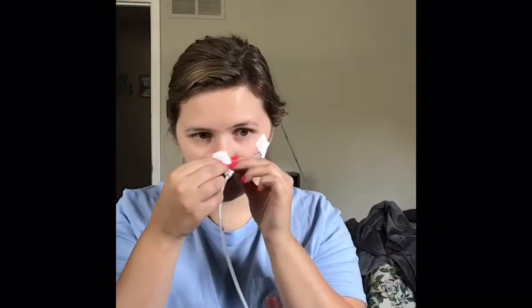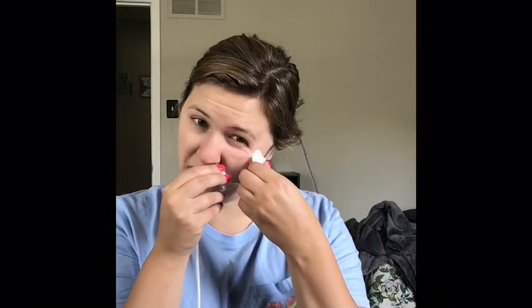So what I'm going to do is have my patient hold their breath, just for prevention of aspiration. And I'm going to undo my tape here, undo the wings, and I would put a towel across their chest, just in case anything comes out, like gunk and everything. And then get some water for them, just so after I take this out, it's not grossness just sitting in their throat. So I would undo my tape here and hold it securely. Oh gosh.